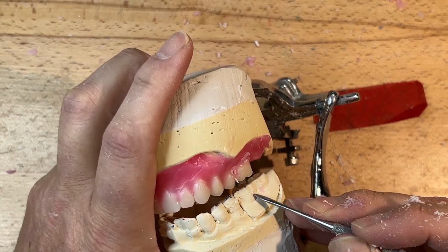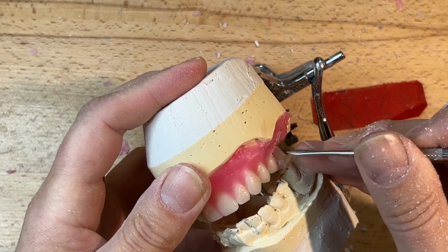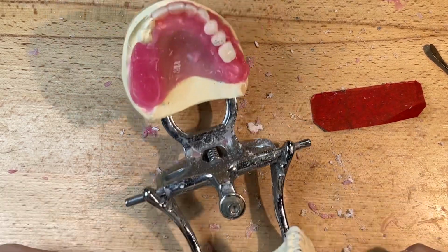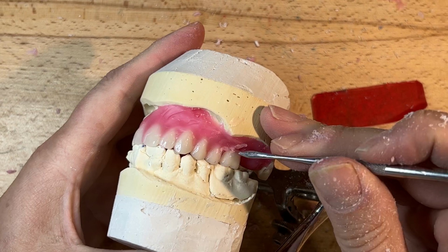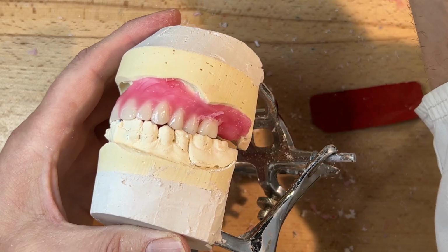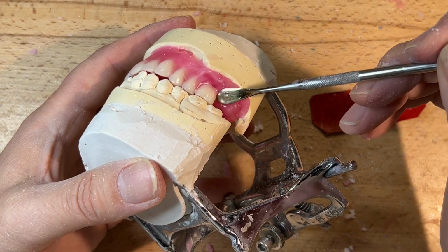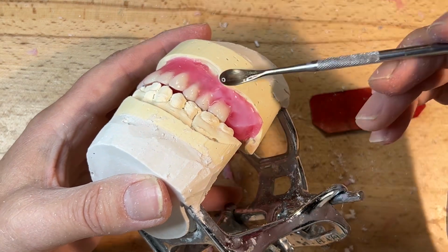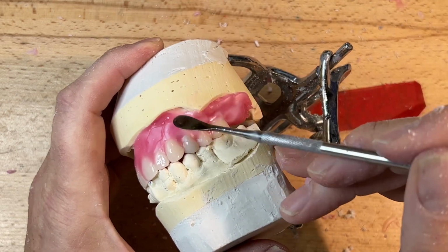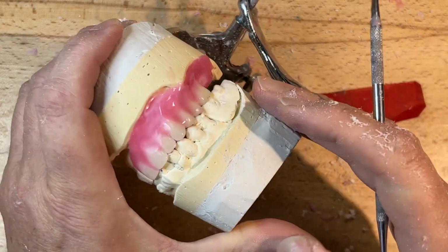Even though this number 6, when it was fabricated from a previous laboratory or denturist or technician, it looks a little bit higher than the occlusal plane. But we don't know, this was maybe created to fit an existing acrylic partial, and that acrylic partial has probably settled. So then this was lifted up at the same time. I think it would be prudent to create these two prosthetics at the same time and maintain the same shade, control, and engineering of the posterior teeth. But for many reasons, these things are done at a different time, maybe years apart here. And then possibly when the final denture is created, whether that's within a year, if this is an interim full immediate denture for a year, then maybe at that time replace both prosthetics and then better level this posterior occlusion.